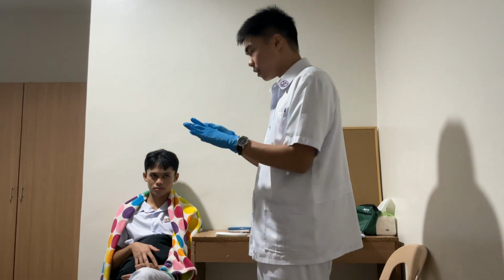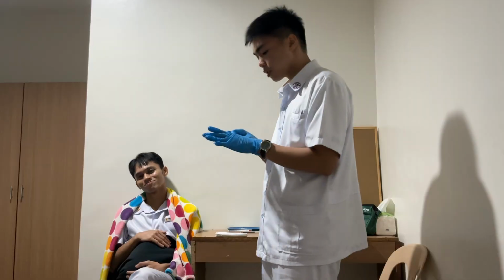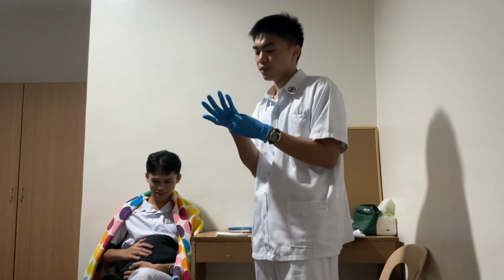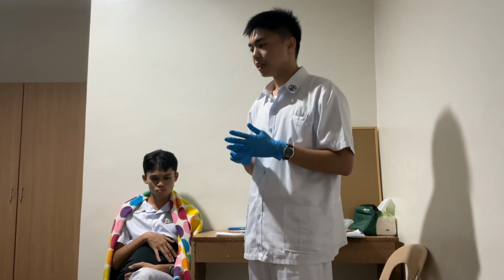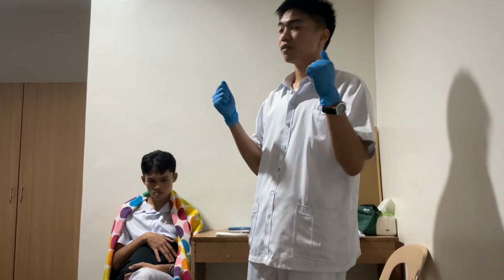Again, ma'am, I would like to inform you that everything that will be disclosed and gathered this afternoon, as usual, will remain confidential and private. It's between the both of us, so you don't have to worry about anything else. Since I'll be taking the temperature first, now I will position the client appropriately. Since the best optimal way of taking the temperature is via the axillary method, I will let the patient sit down properly and comfortably and insert the thermometer.